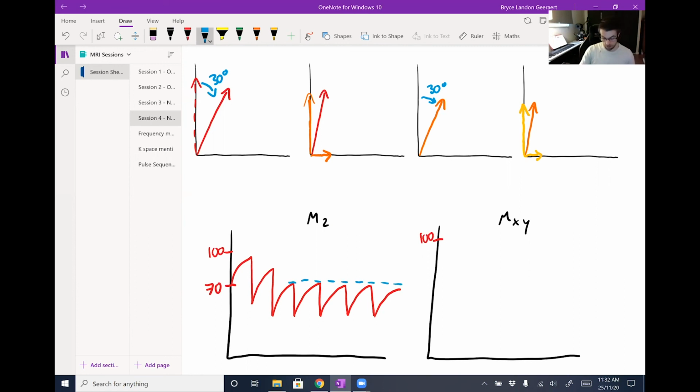So you can see how this kind of plateau that's reached is the same every time. It might not be at this exact quantity. It depends on a lot of factors, but the idea is that the amount of magnetization that you are now observing is the same instead of changing every time. And this allows you to measure information from the NMV in a consistent way without waiting forever for the NMV to recover fully, right? Because previously we've been talking about letting the NMV recover fully because then we have a consistent magnitude to record. Now we can do that, have that consistent magnitude.